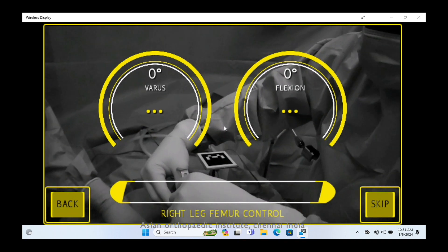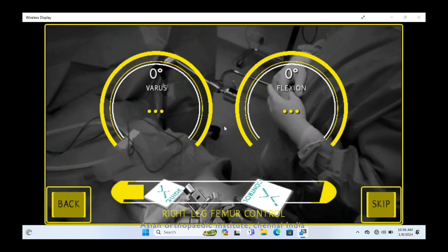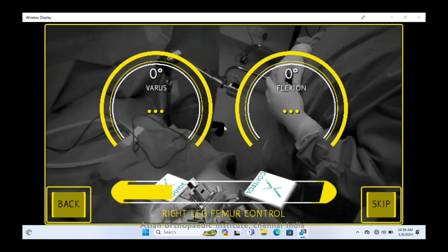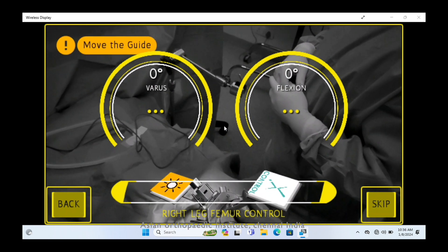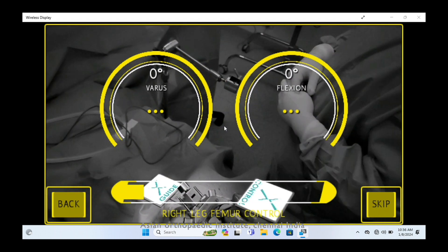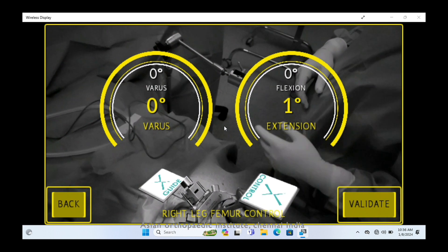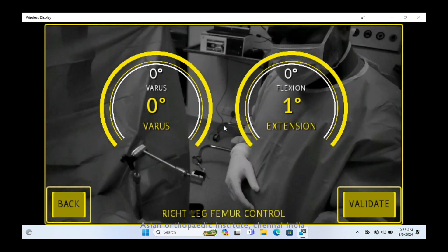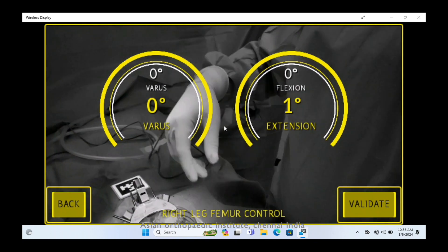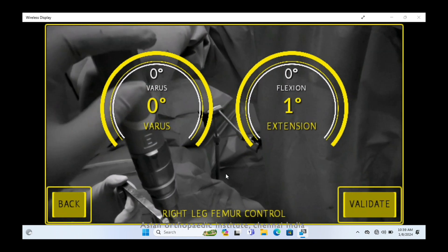On clinical examination, if you find the knee lax or tight, based on that you determine the amount of bone to be removed. This system gives you both coronal and sagittal plane cut execution in real time. Once you've done your distal femoral cut, you shift to the tibial cut.